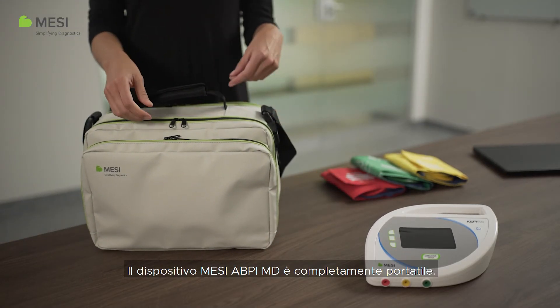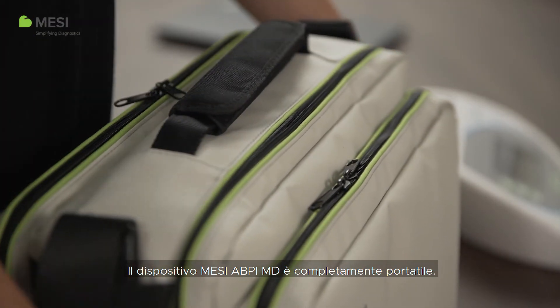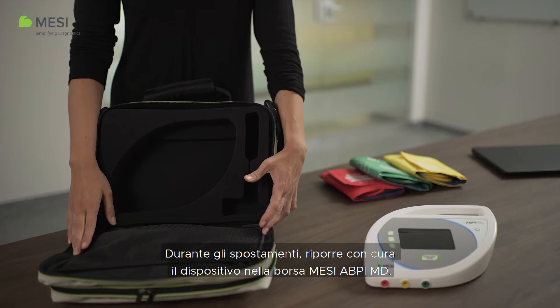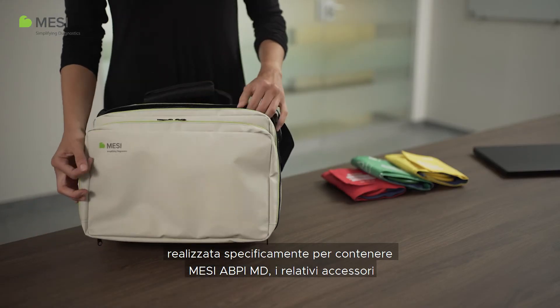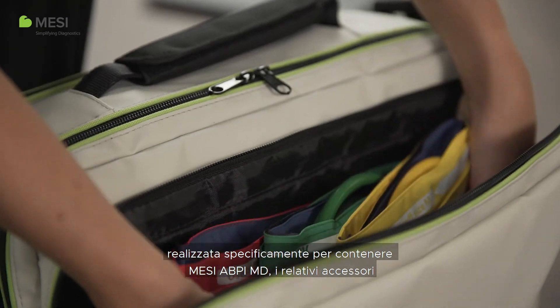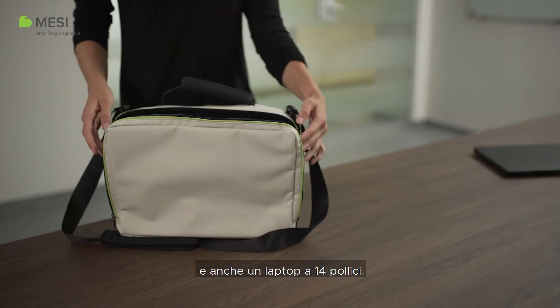The MESI ABPI-MD is completely portable. Store the device safely when you're on the go in the MESI ABPI-MD bag, specifically designed to hold the MESI ABPI-MD and its accessories, as well as a 14-inch laptop.